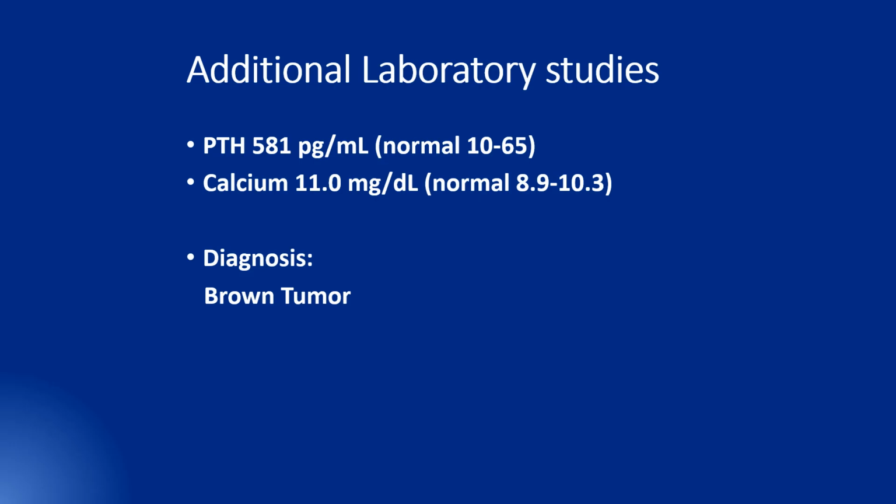At this point, with histopathologic findings, we were dealing with a giant cell rich lesion, which resembled giant cell tumor in some areas and giant cell reparative granuloma in other areas, which raised the possibility of brown tumor. I asked the clinician about PTH and calcium level, and he said that they did not order them. When they ordered them, parathyroid hormone was really increased and calcium maybe slightly increased. So based on histopathological findings in correlation with laboratory findings, we diagnosed brown tumor secondary to hyperparathyroidism.